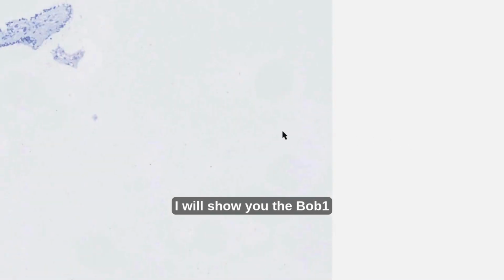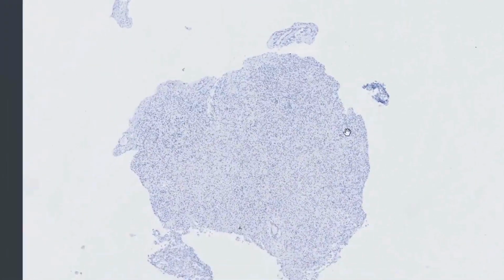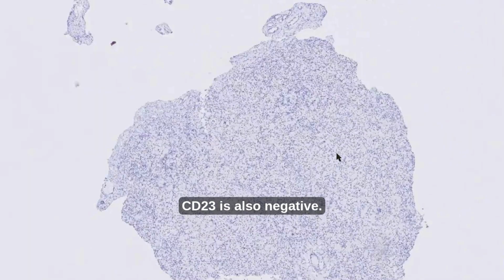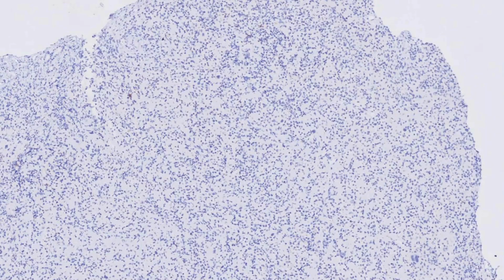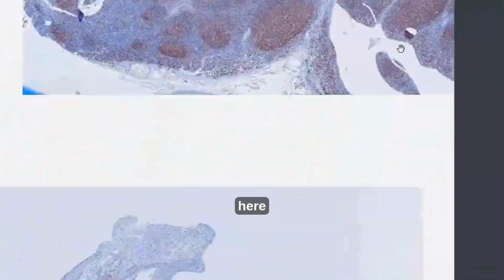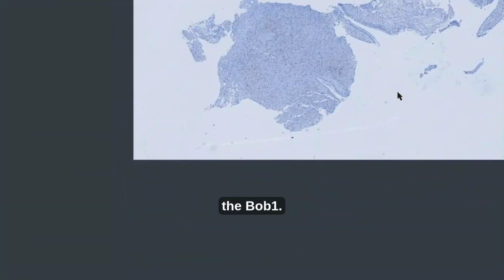I will show you the BOB1 a little bit. ALK is negative. CD23 is also negative. And I think we have here the BOB1.